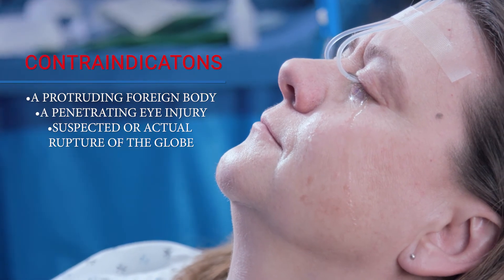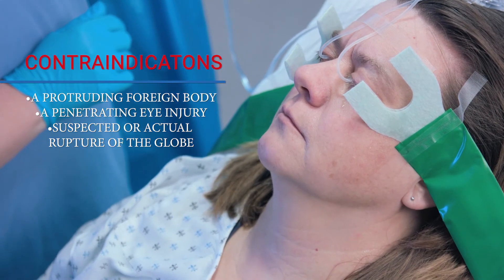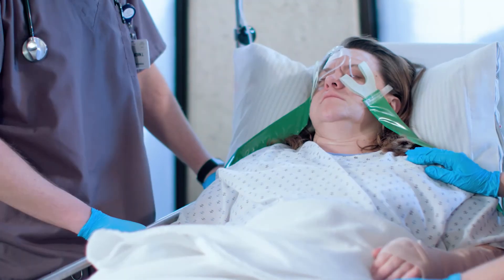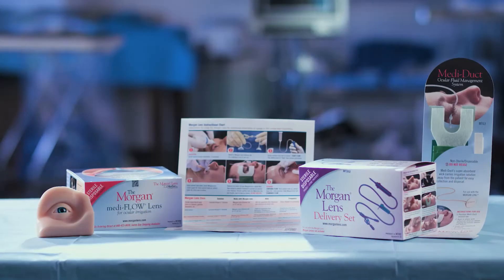Contraindications include a protruding foreign body, a penetrating eye injury, or suspected or actual rupture of the globe. In all other cases, begin immediate irrigation and wait to perform a more detailed evaluation or history until treatment is underway.